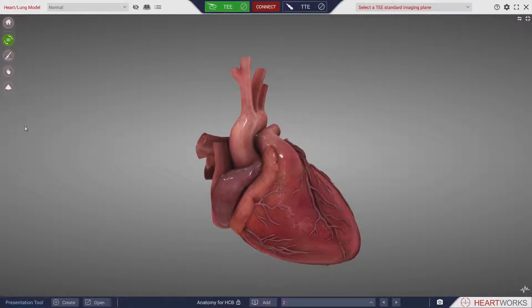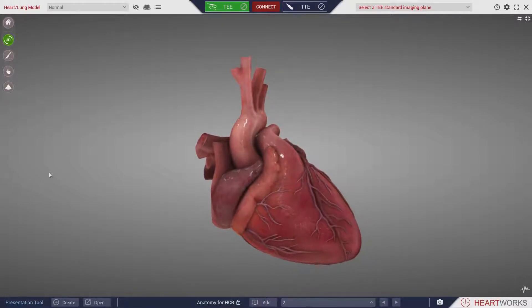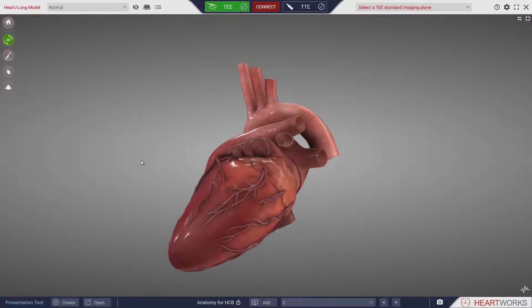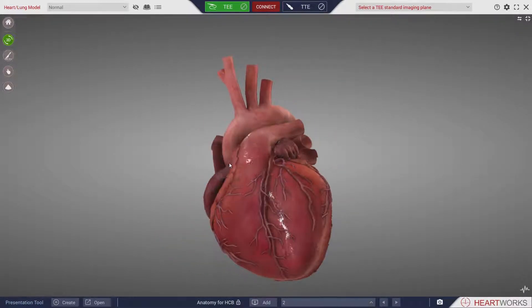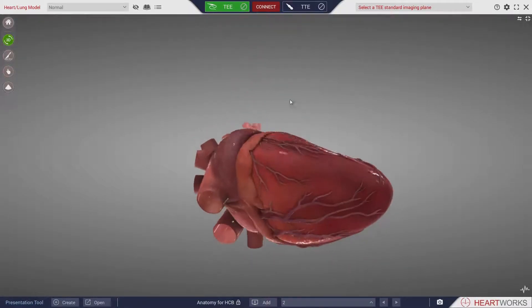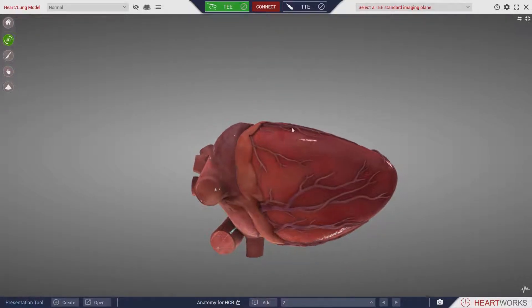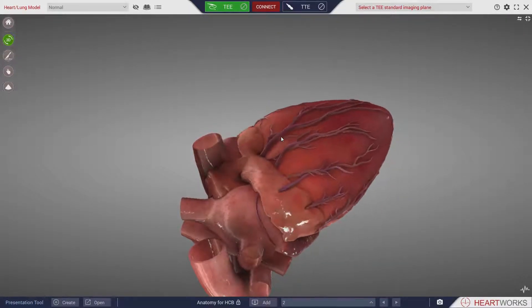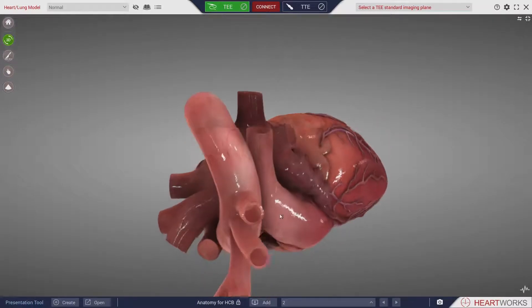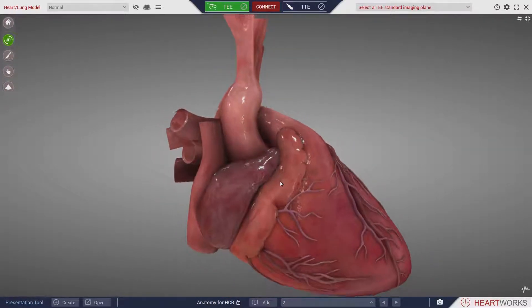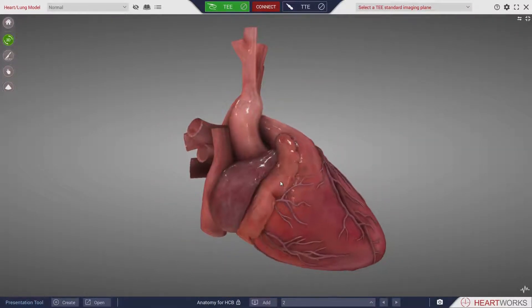With the heart still or beating, it can be viewed from any perspective. Using the mouse controls to tumble, zoom, or drag the heart on the screen, the anatomy can be explored interactively.